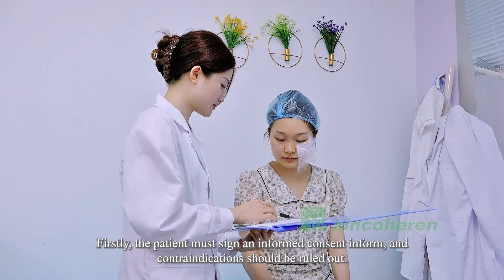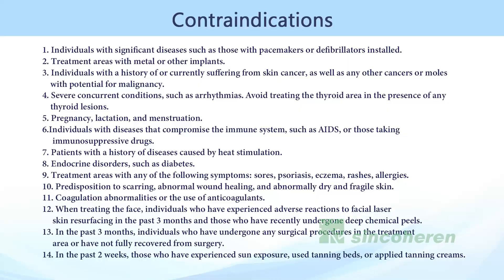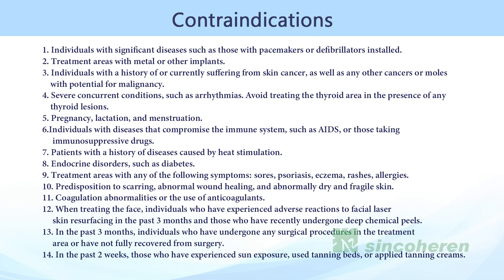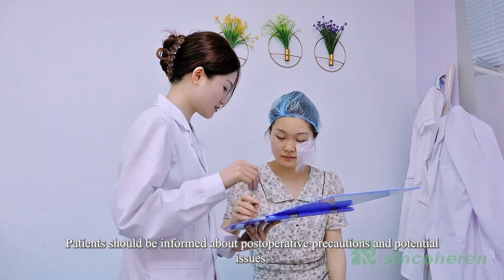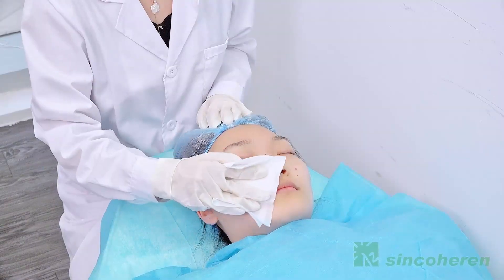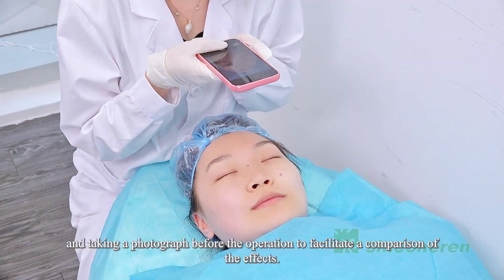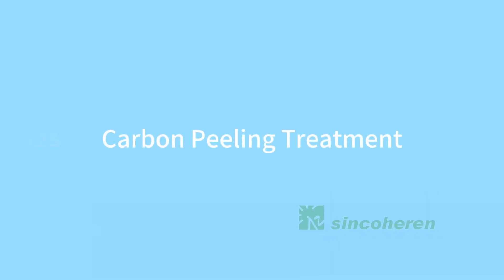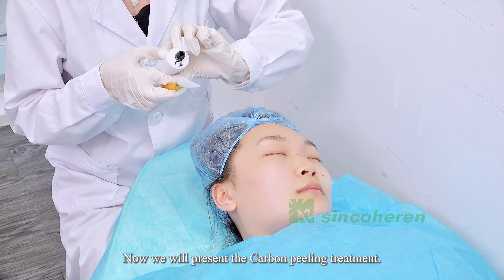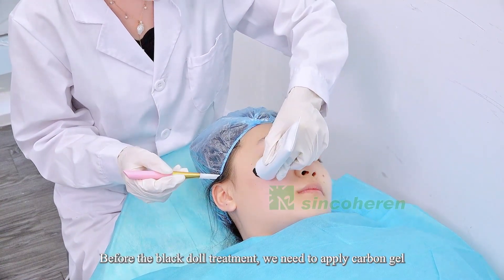Next, we introduce the operation procedures. Firstly, the patient must sign an informed consent form, and contraindications should be ruled out. Patients should be informed about postoperative precautions and potential issues. The subsequent step involves cleansing the patient's skin and taking a photograph before the operation to facilitate comparison of the effects.